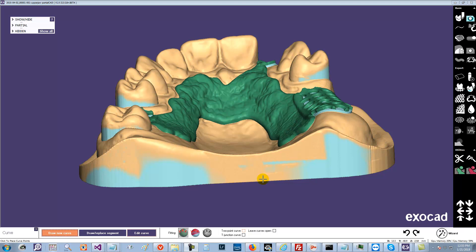I'd like to show you a couple of tricks with the support bars. There's been some requests to have sprues instead of just support bars, and there's sort of a workaround that you can get that to work.